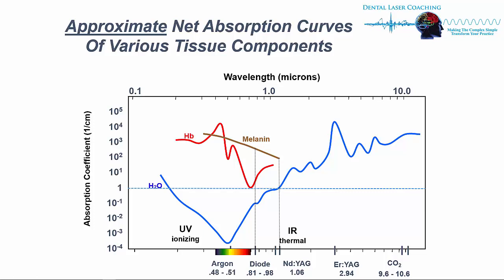Now before I move on, you can see here that the diode lasers, the 800s to around the 980s, have no interaction whatsoever with water. It's below our baseline. It does not interact with them. So these lasers have nothing to do with water.